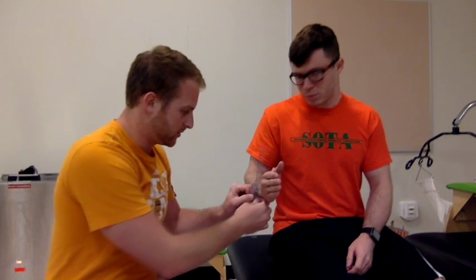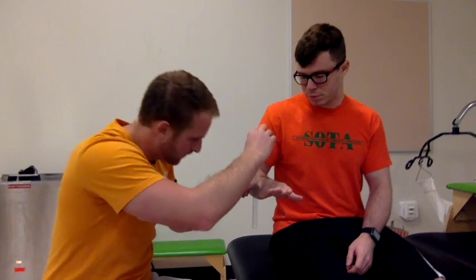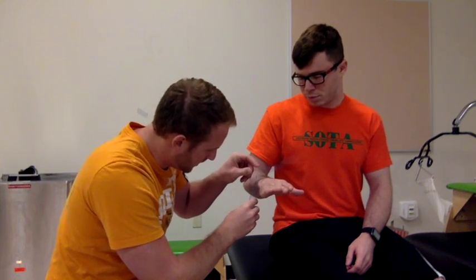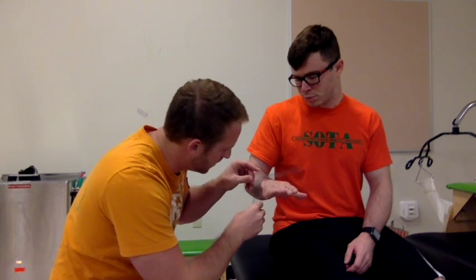This is forearm pronation. The axis is on the proximal side of the styloid process of the ulna. Perform pronation for me. You have to follow along. The axis moves a little bit. The stationary bar perpendicular to the floor, and 75 degrees was our angle.